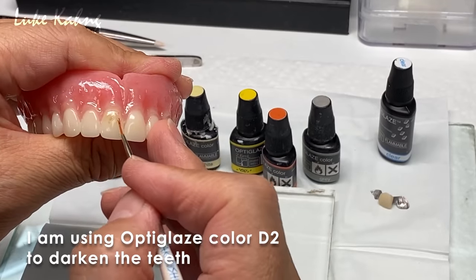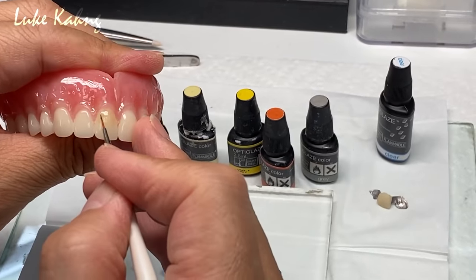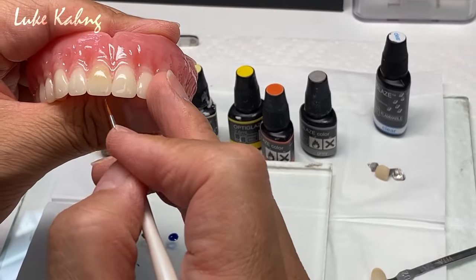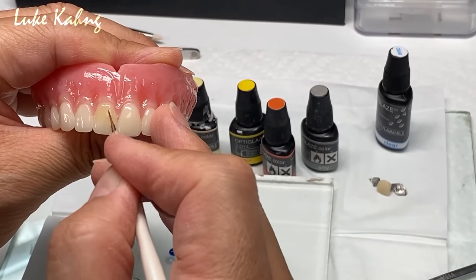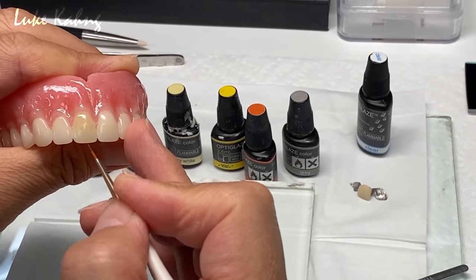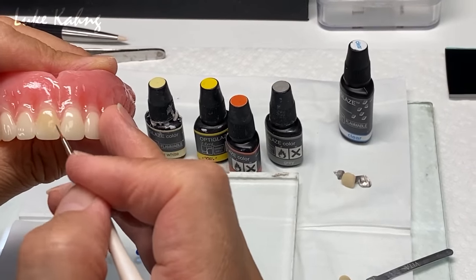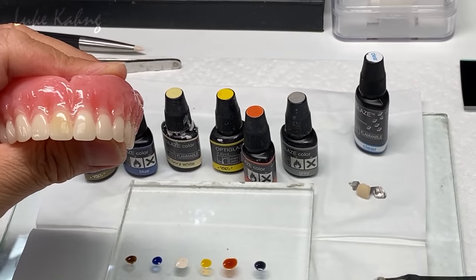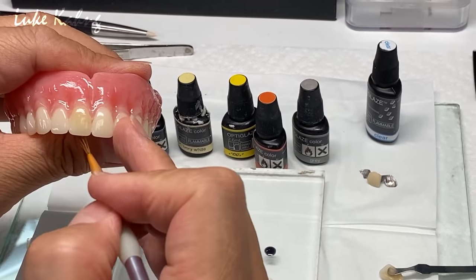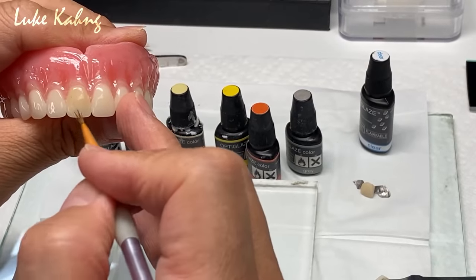Go ahead. So let's make more darker, which is the D2. This material is very sensitive, so you have to do just light. So all the way from the incisor 1/3, so I make the more enamel effect. Okay. So like that D2, it's a little bit dark, so then just take it out. Okay.